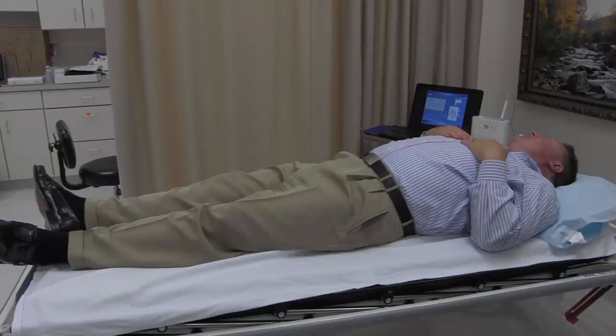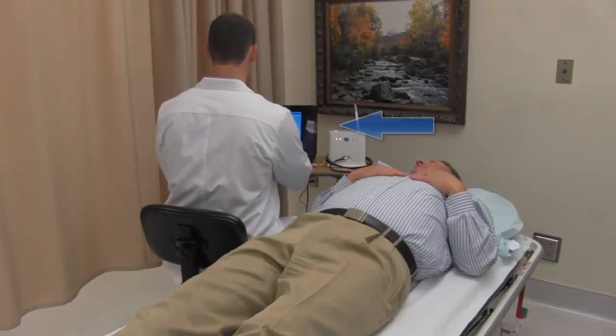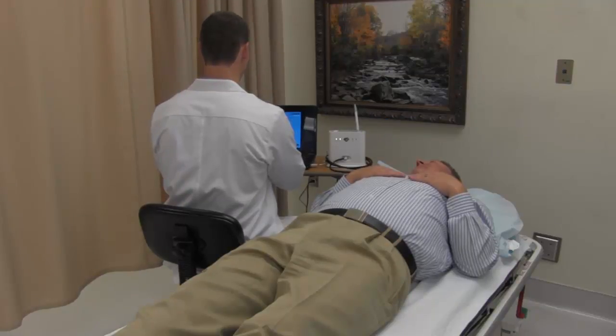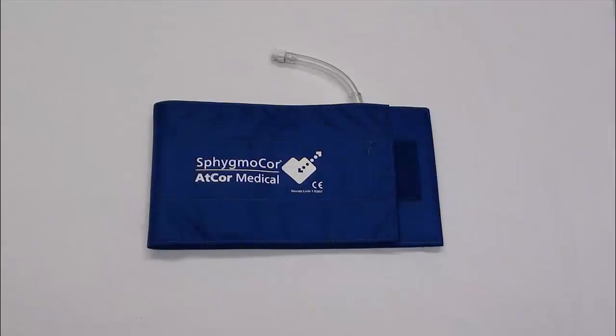It is important when conducting a pulse wave velocity assessment to arrange the room so that the computer screen can be easily viewed by the operator during data capture. In most cases, this is achieved when the computer is placed next to the head of the bed or exam table, the same end where the patient's head will rest. If the screen is in a position that is difficult for the operator to view, it could make data capture challenging. To prepare for pulse wave velocity, the patient should be in the supine position and have rested for at least 5 minutes before beginning the assessment.